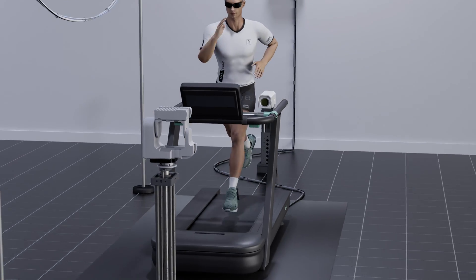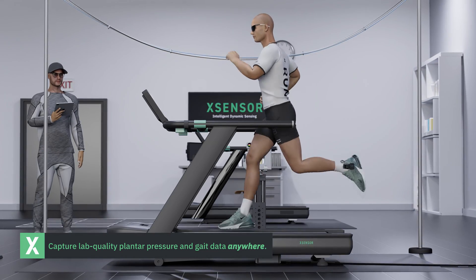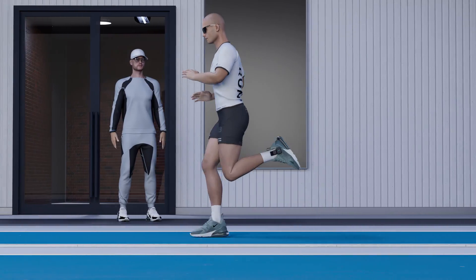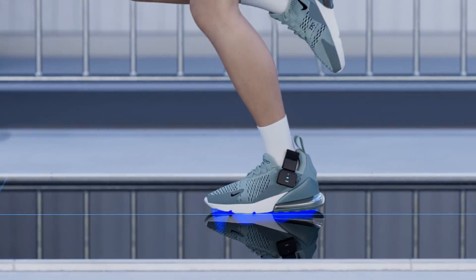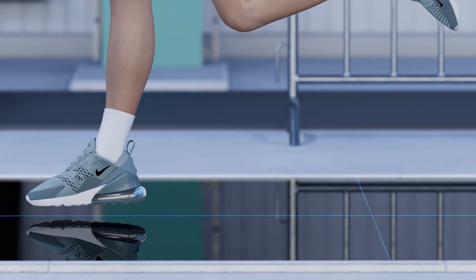With a robust design, the Portable Intelligent Insoles Toolkit enables you to capture lab-quality data anywhere — in the lab or the field. The accurate data, captured in high spatial resolution, quantifies the slightest changes in pressure. Precise foot position and timing, collected with the Integrated Inertial Measurement Unit complemented with the pressure data, provide complete interaction of the plantar surface.